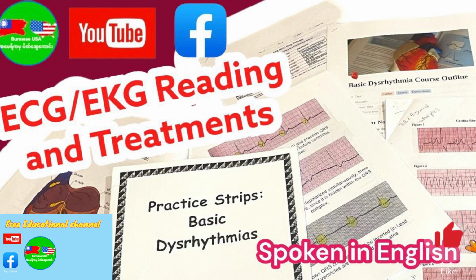Okay, so every cardiac cycle should produce a pulse. That's why you have to put your hands on the patient and feel the pulse, because sometimes there's no pulse, but the electrical activity is there. That means there's no effective cycle. So if you see the ECG is okay, that doesn't mean the patient is okay.